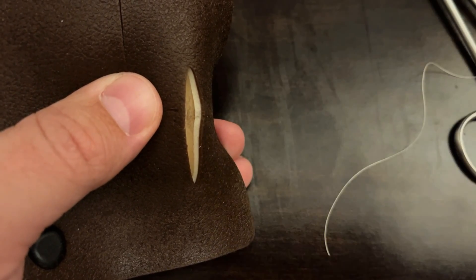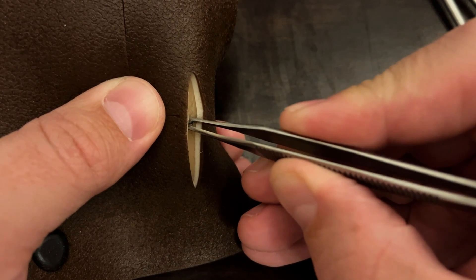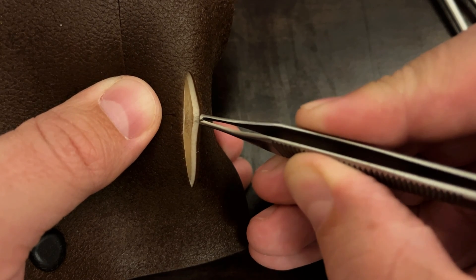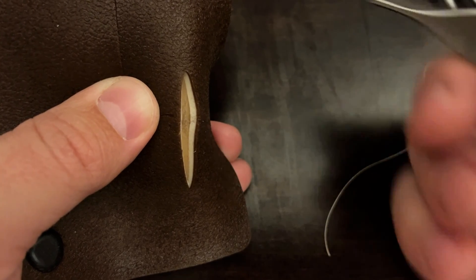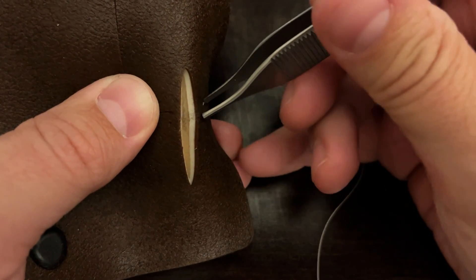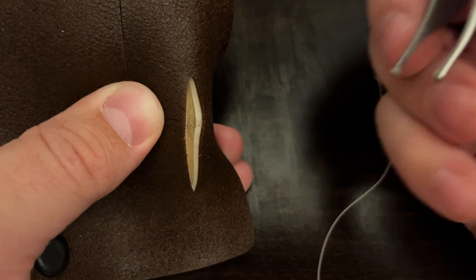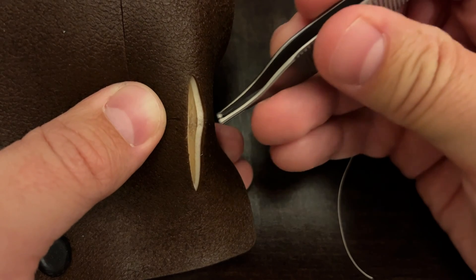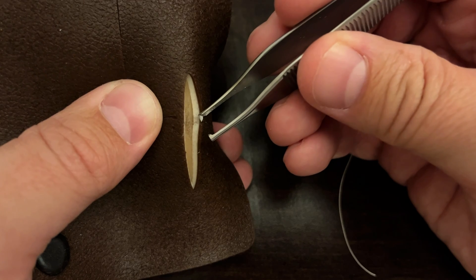Using this suturing technique, we're really going to be focusing our suture in the subcutaneous fat, coming through the dermis without piercing the epidermis, and using the dermis as the stronger, tougher tissue. The dermis is a lot stronger than the subcutaneous fat below it. It's a little bit of a misnomer to say we are suturing in a subcuticular fashion because in reality the dermis is part of the cutis, but that's the way this has been historically named.